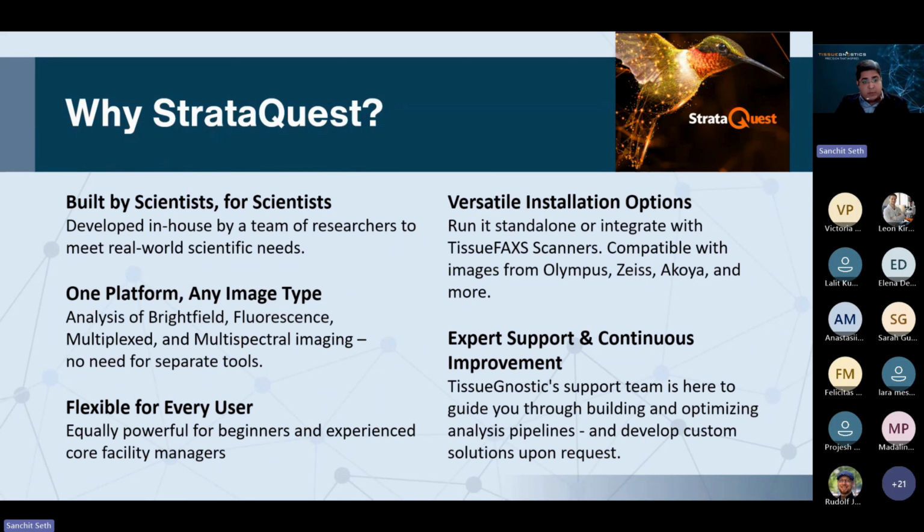The next point is flexible for every user. StrataQuest is equally powerful for beginners and experienced core facility managers. We will be seeing this today in the live samples as well, that in StrataQuest, you can create your own workflows depending on the requirements of the researchers. At the same time, we also assist the researchers to develop their workflows, and we provide it in an easy mode. We call it StrataQuest apps. So we will be seeing how you can use those apps as well.